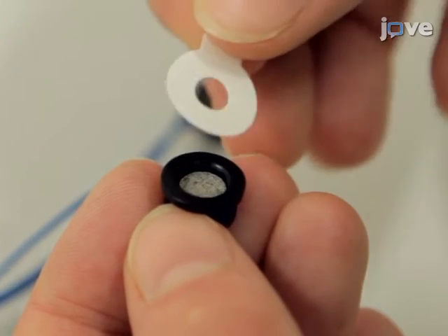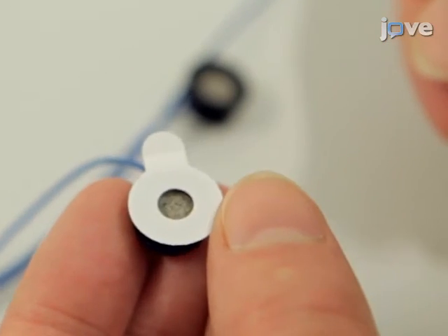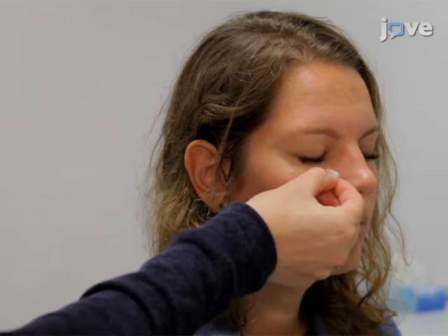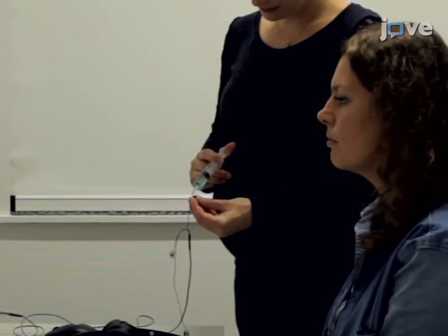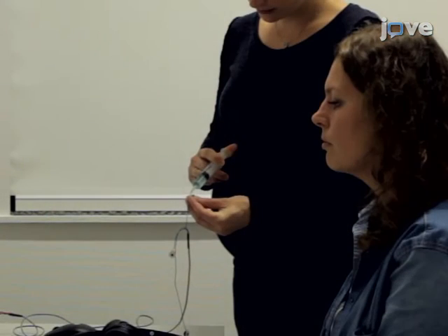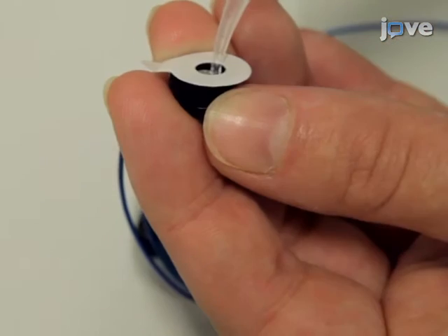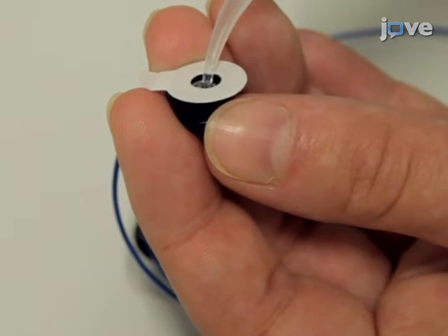To begin, attach the double-sided adhesive collars to the EMG electrodes. Use an alcohol swab to clean the participant's skin below one eye and on the forehead. Instruct the participant to keep their eyes closed to avoid potential irritation. Next, fill the center of the EMG electrodes with highly conductive electrolyte gel using a syringe.